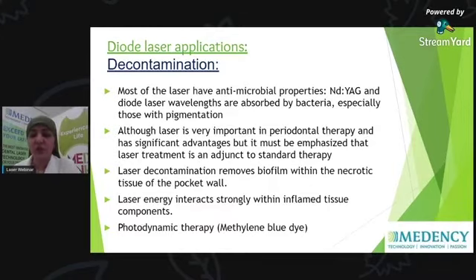So you cannot remove calculus with diode laser, but you can do a decontamination using diode laser after the scaling procedure. Also, the way the laser decontaminates the pocket is by removing the biofilm within the necrotic tissue of the pocket walls, and it interacts within the inflamed tissue components.